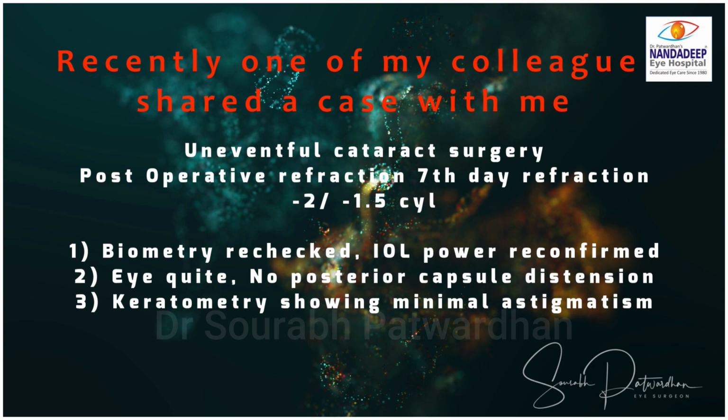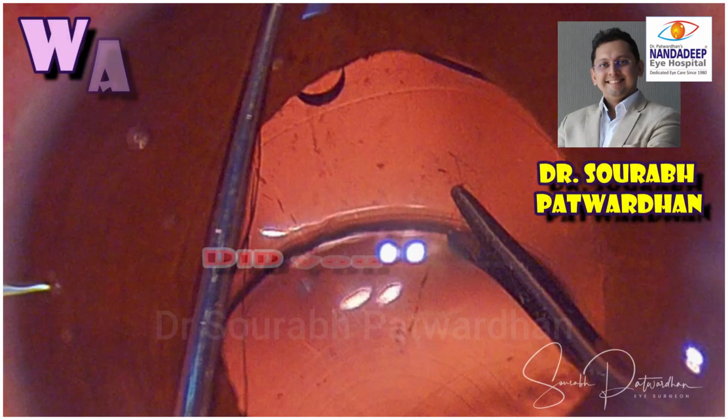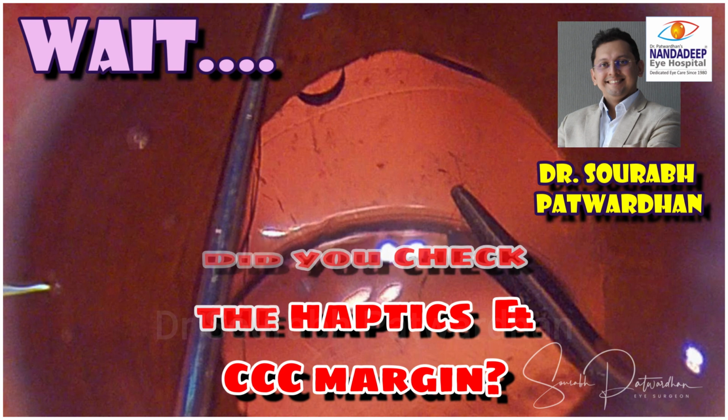There was one more differential diagnosis, that the IOL was tilted because the haptic was not in the bag. So I told the surgeon, did you check the haptics and the CCC margin at the end of the surgery?